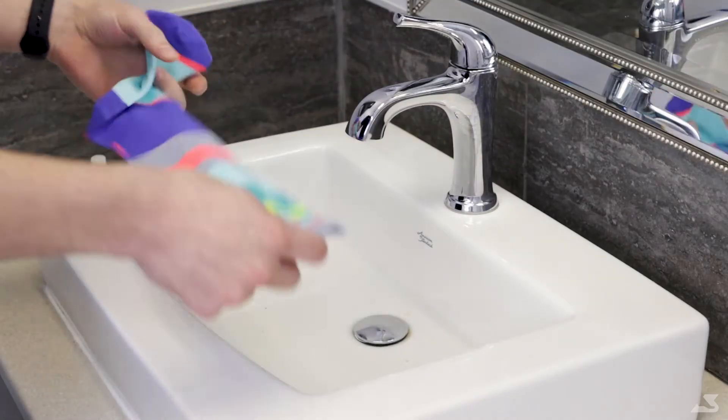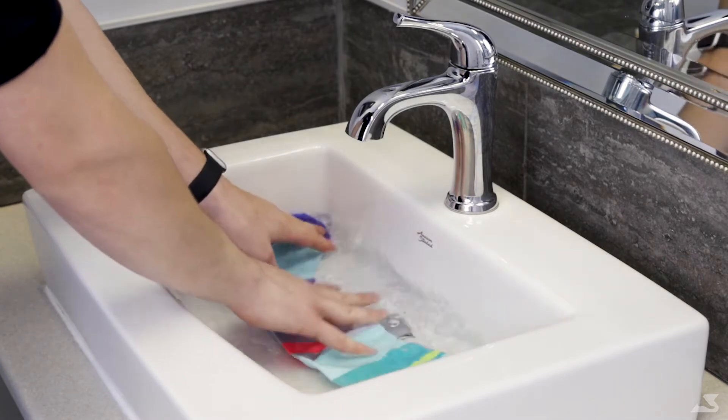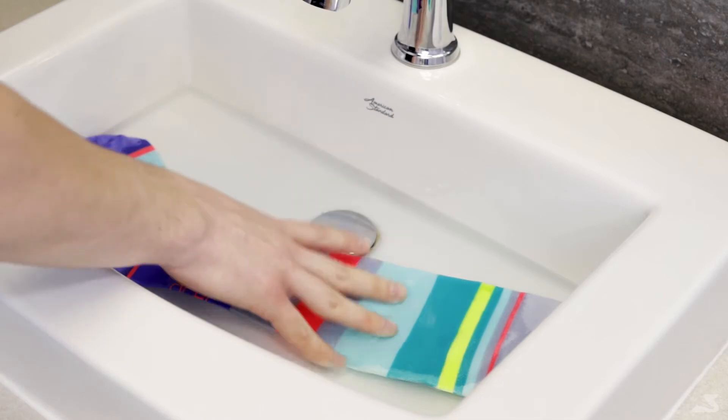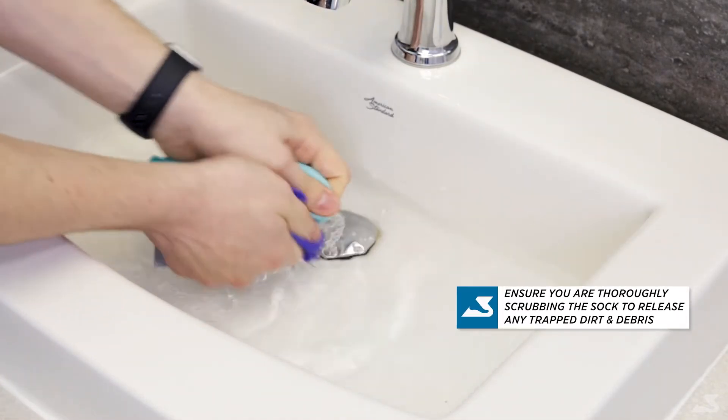Begin by filling up your sink or a bucket with warm water. Then, submerge your garment into the water. Add some soap and scrub the foot area from heel to toe with your hands, ensuring you really get the soap into the fabric.